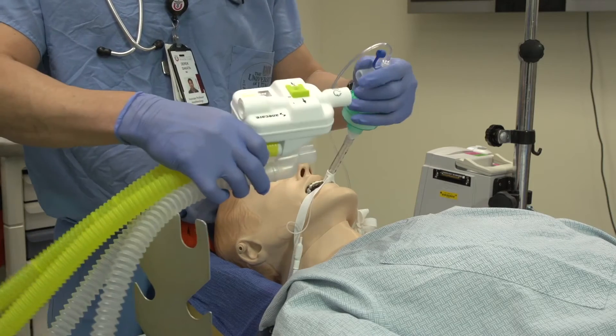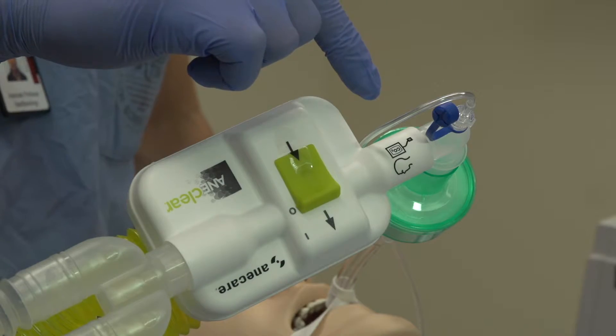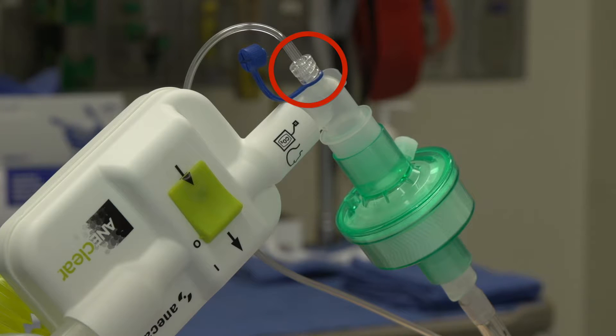Place AniClear between the patient and the anesthesia breathing circuit, noting the visual image prompts on the device for correct placement. AniClear can be used with either a dual limb parallel Y or coaxial tubing anesthesia circuit placed behind the device. The gas sampling port needs to be placed between the patient and AniClear to ensure that the displayed gas readings represent the actual inhaled and exhaled gas concentrations of your patient.